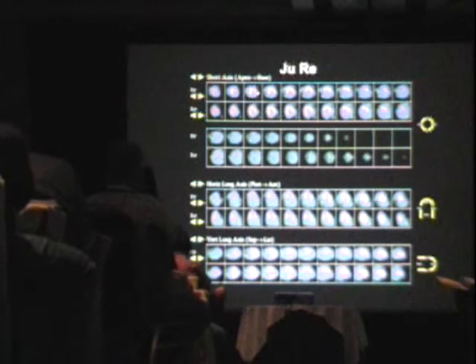Now you're talking about the inferolateral wall of the heart showing reversibility, and this would be more typical for the obtuse marginal distribution. And the clues to differentiate obtuse marginal from the right coronary artery, it's a difficult area, are: is the inferior septum at the base involved in the defect or not? If it is, like in this case, you lean more to the posterior descending. Whether that arises from the circumflex or the right coronary, it doesn't matter.